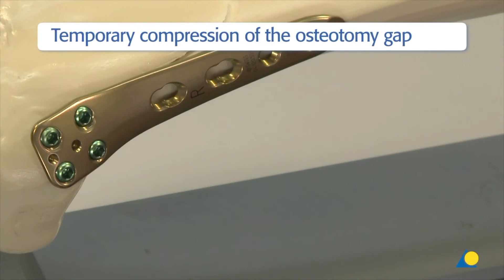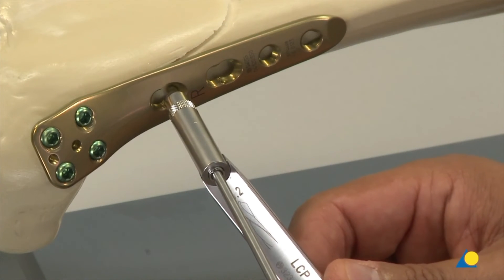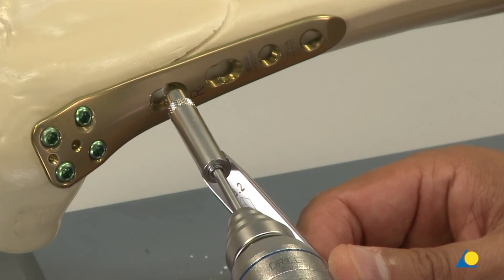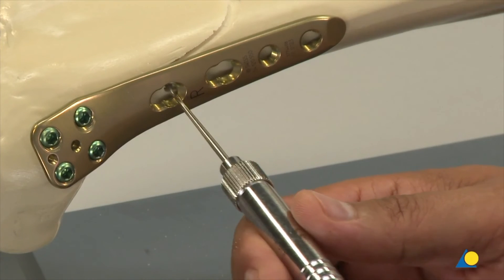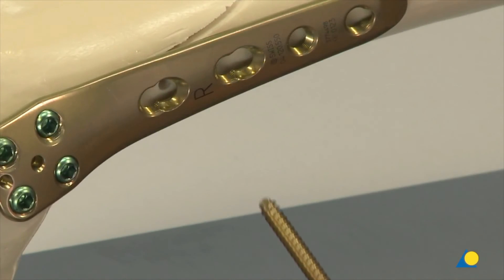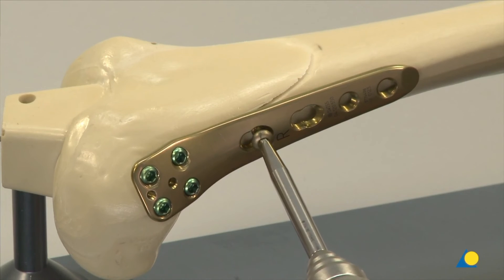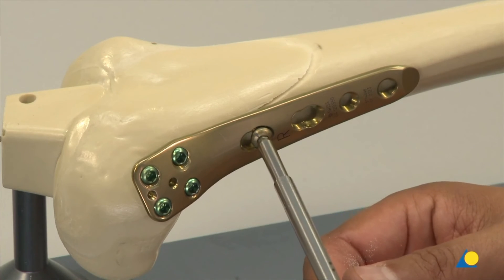To compress the osteotomy gap, a 4.5 mm cortex screw can be inserted eccentrically proximal to the osteotomy in the dynamic part of combination hole 1. The screw length is determined from the depth gauge. To achieve good interfragment compression, the screw should be inserted perpendicular to the plate surface. This is particularly important if the lateral cortical bone fractured as the osteotomy was closed. In this situation, aiming the screw more proximal will compress the lateral cortical hinge point even more. The screw should be finally tightened by hand.